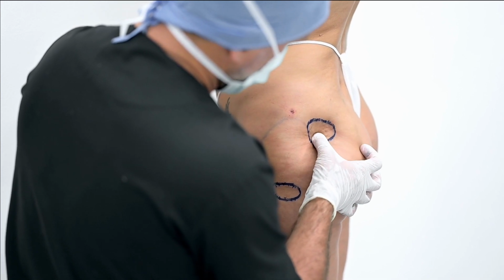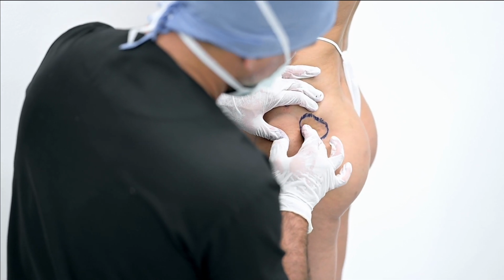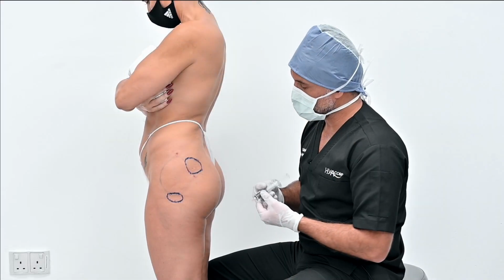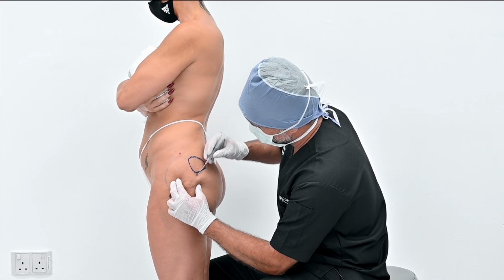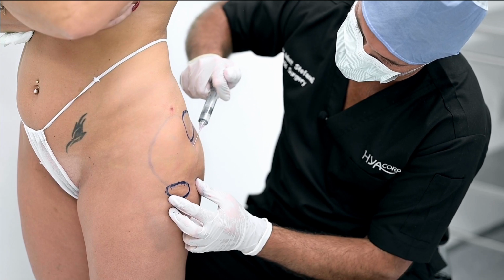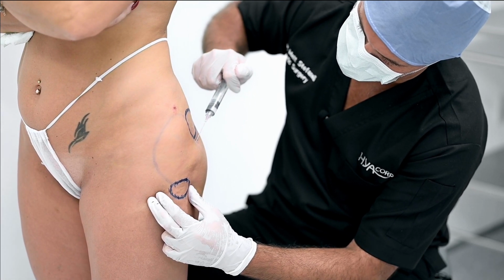So we make a massage, and you see this is a good part of this product. It's very easy to mold. And we finish the treatment with this final touch-up. With half a syringe to make a nice and smooth transition zone.